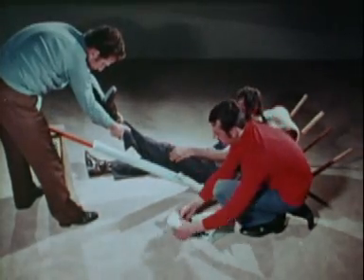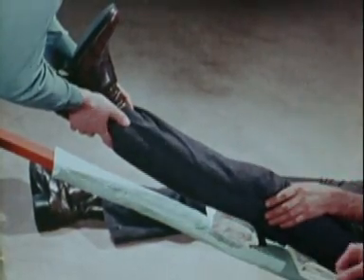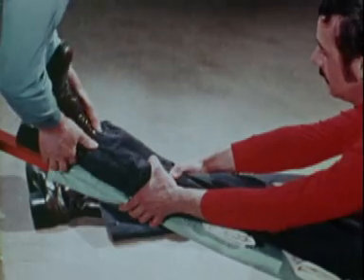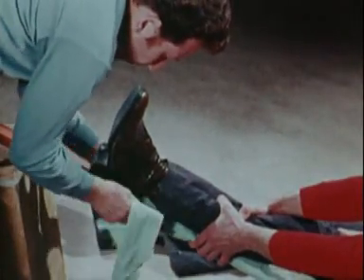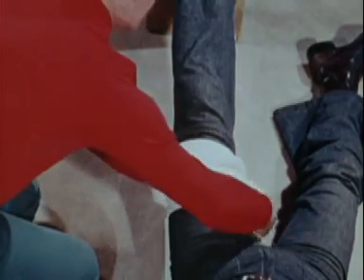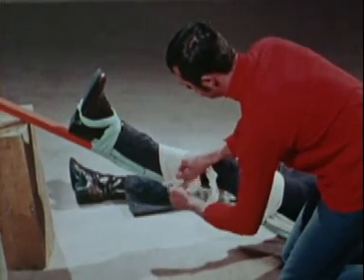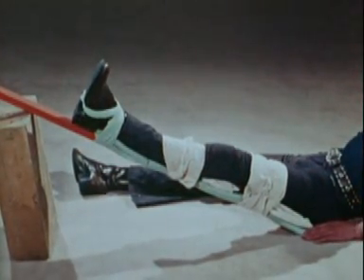Hold the injured limb raised above the splint and add extra padding in the hollow behind the knee and under the ankle, then gently place the injured limb on the splint. Hold the splint in place with one bandage tied in figure of eight round the ankle and foot, with a second wide bandage round the hip, and with a third below the knee. The patient should be transported in this position, which reduces muscular tension, but always watch out for shock.